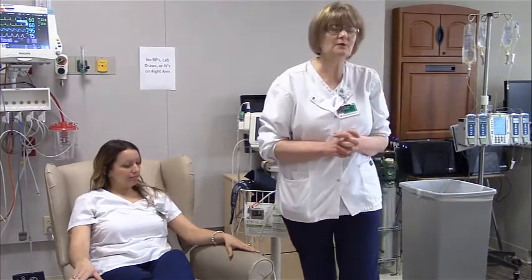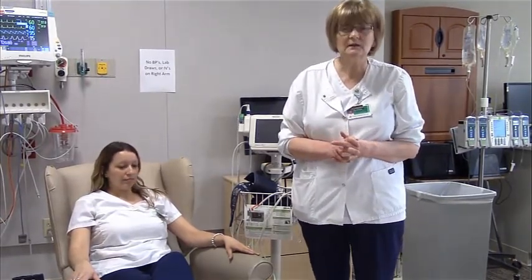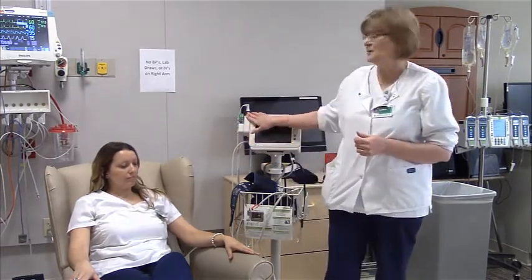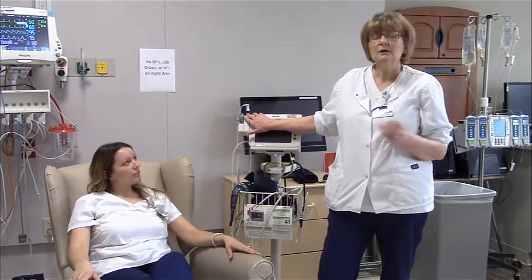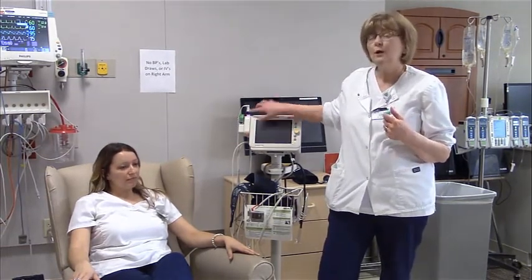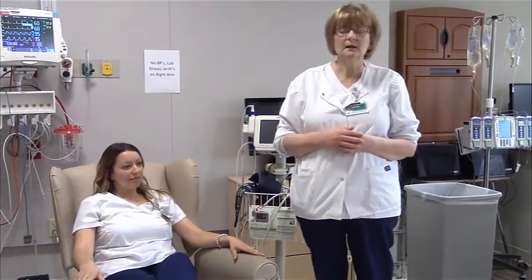The other type of temperature that you may be asked to obtain, and only with the physician order, is a rectal temperature. So you won't be using this particular temperature tool. You'll have to find the one that has the red cap. So if you think red rectal, you'll be able to do a rectal temperature.